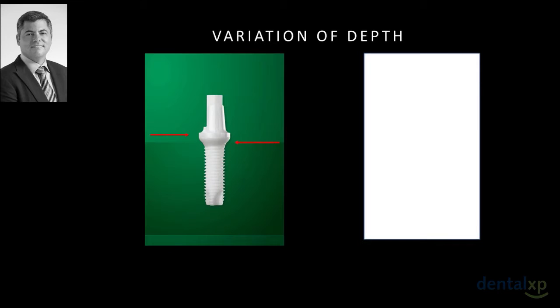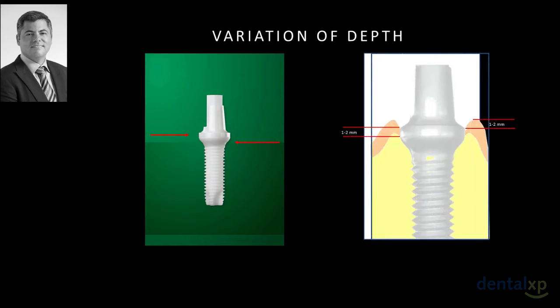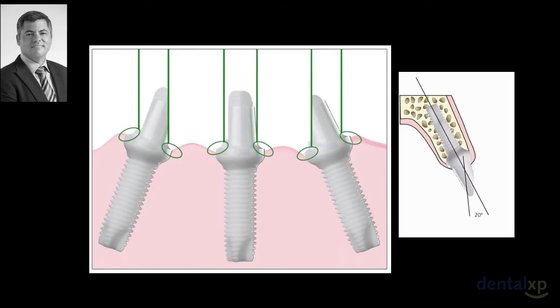Speaking now about some aspects related to the implant placement strategies, it is important for the clinician to position the finish line about 2 mm subgingival. The implant collar is the point of reference utilized to position the implant in relationship to the gingival margins and crestal bone. It gives us some range that we can play with to place the implant lower or higher depending on our clinical necessity. The company protocol recommends placing the implant as parallel as possible, no more than 20 degrees of inclination, if any inclination at all, therefore being an implant system that would greatly benefit biomechanically from computer-guided protocols.